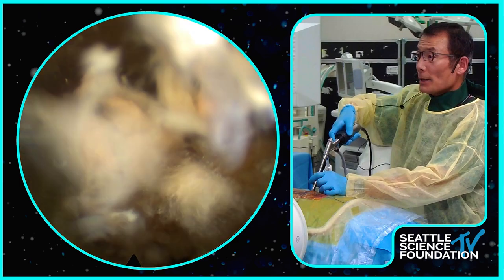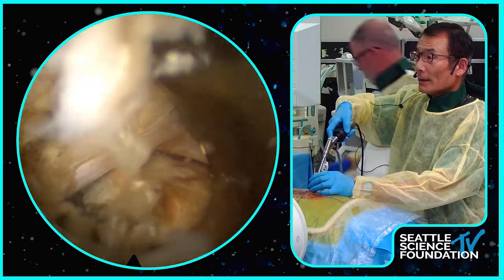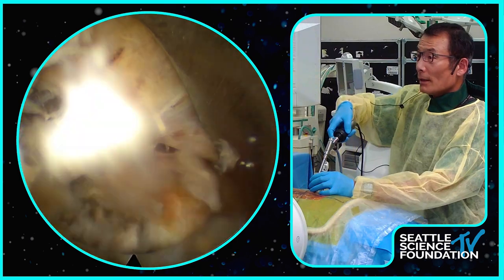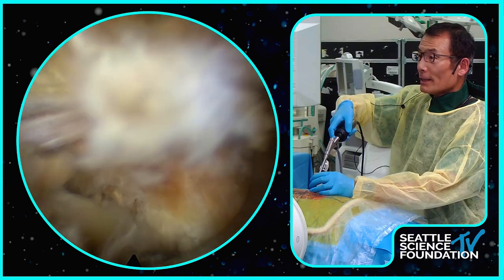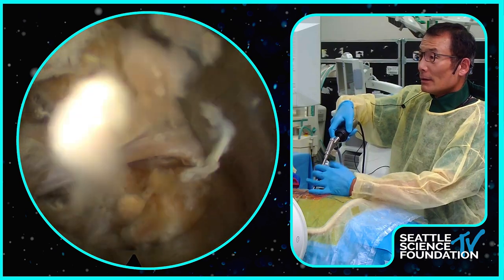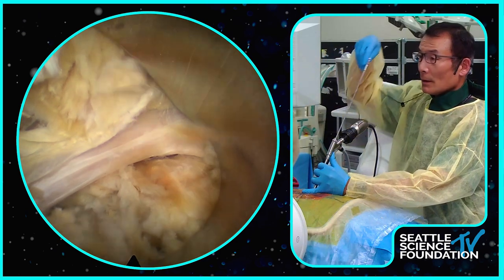Okay. Can you see the image, right? Yes. Okay. So see that's the ipsilateral traversing nerve. Upbiting grasper, yeah. Can I have the grabber? Just give me a big grabber. Give me a straight one on that.